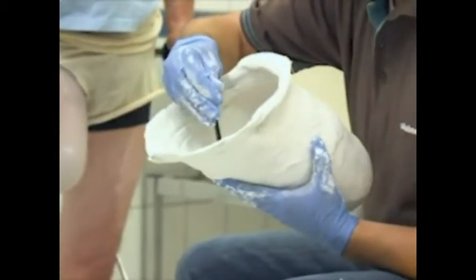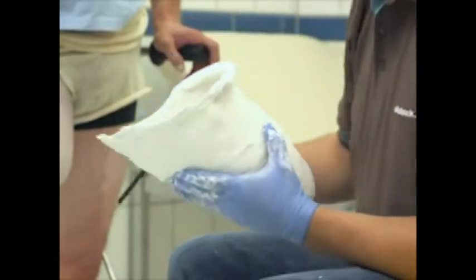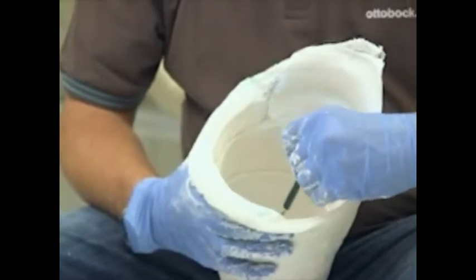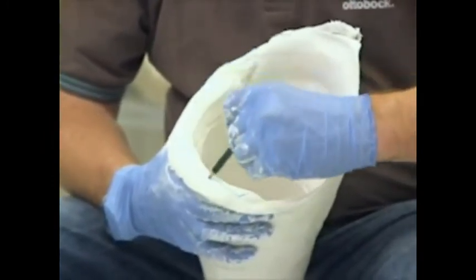Mark the position of the trochanter major in the plaster cast. Marking the ischial tuberosity and the intersection point of the ischial ramus. The adductors are located here.